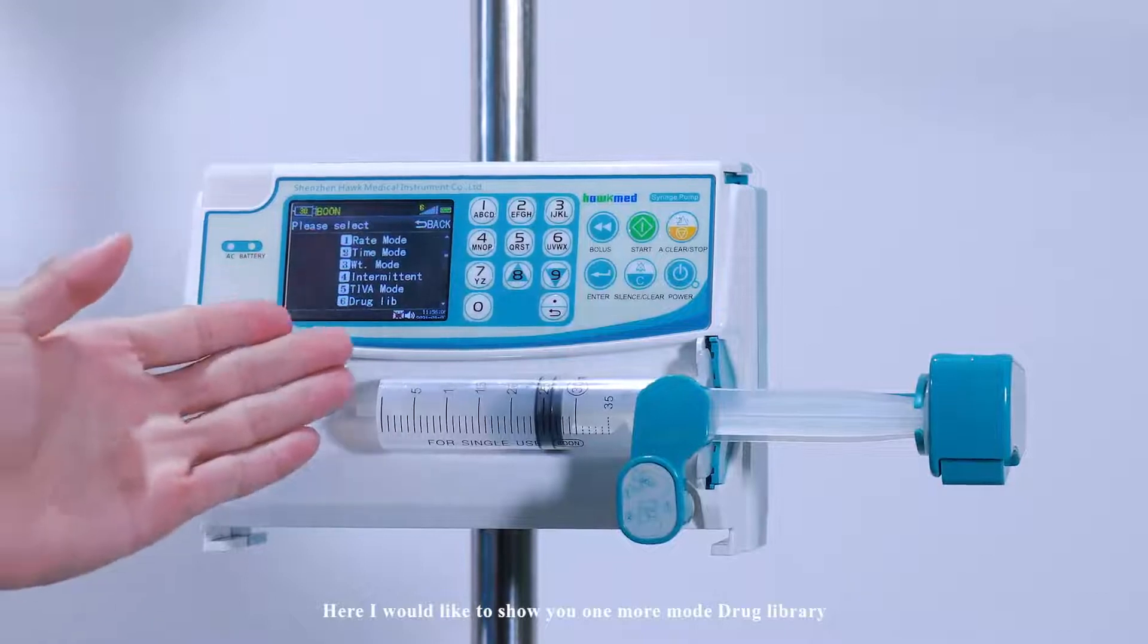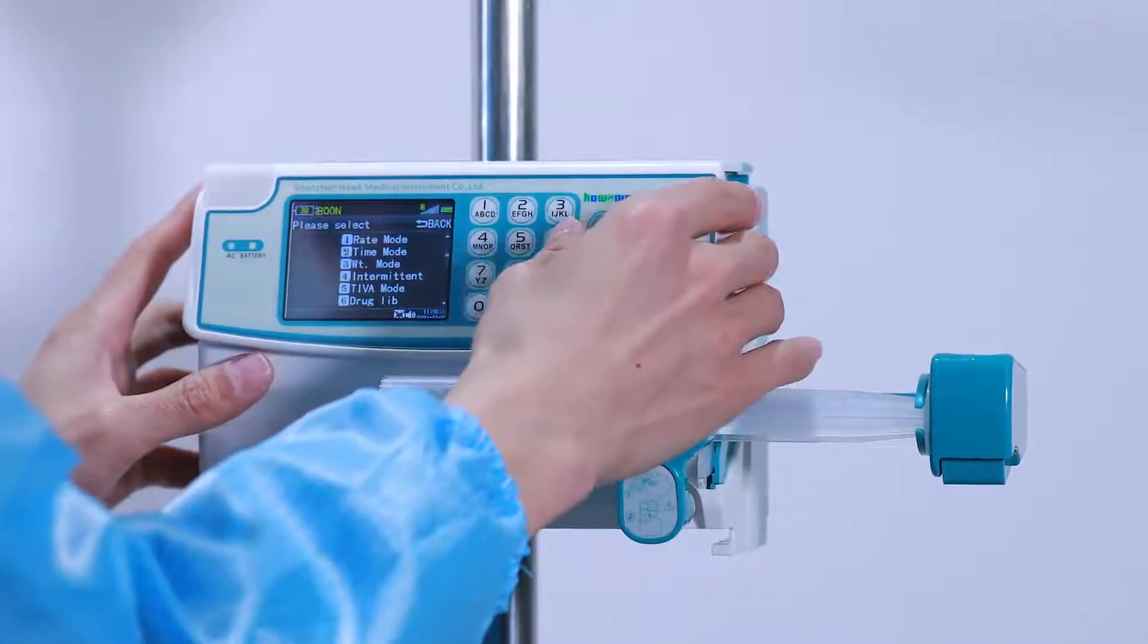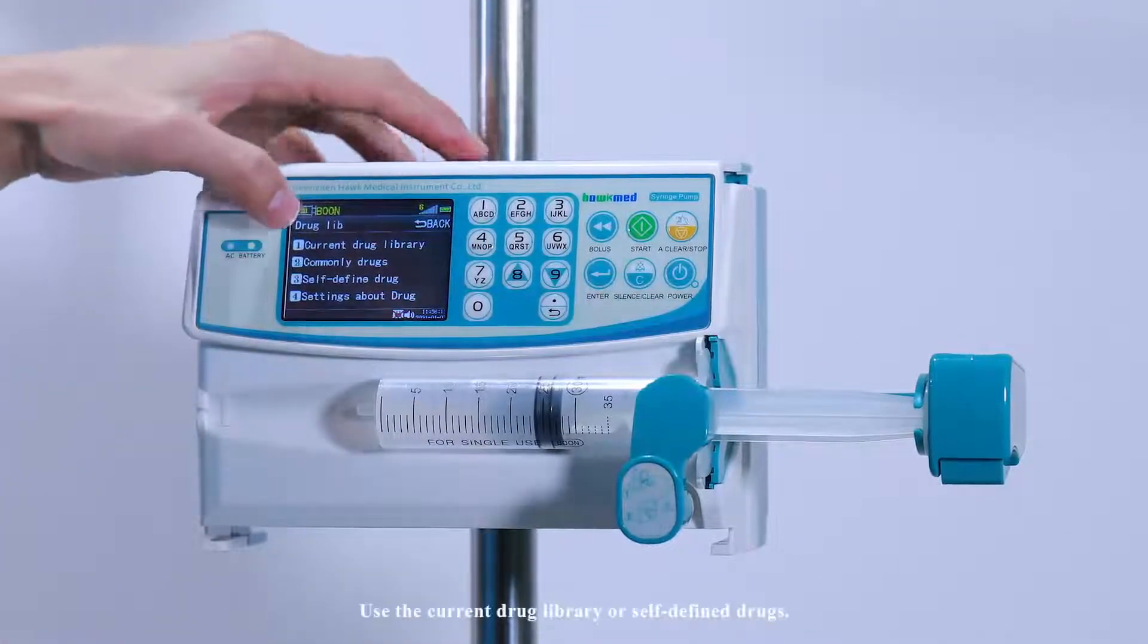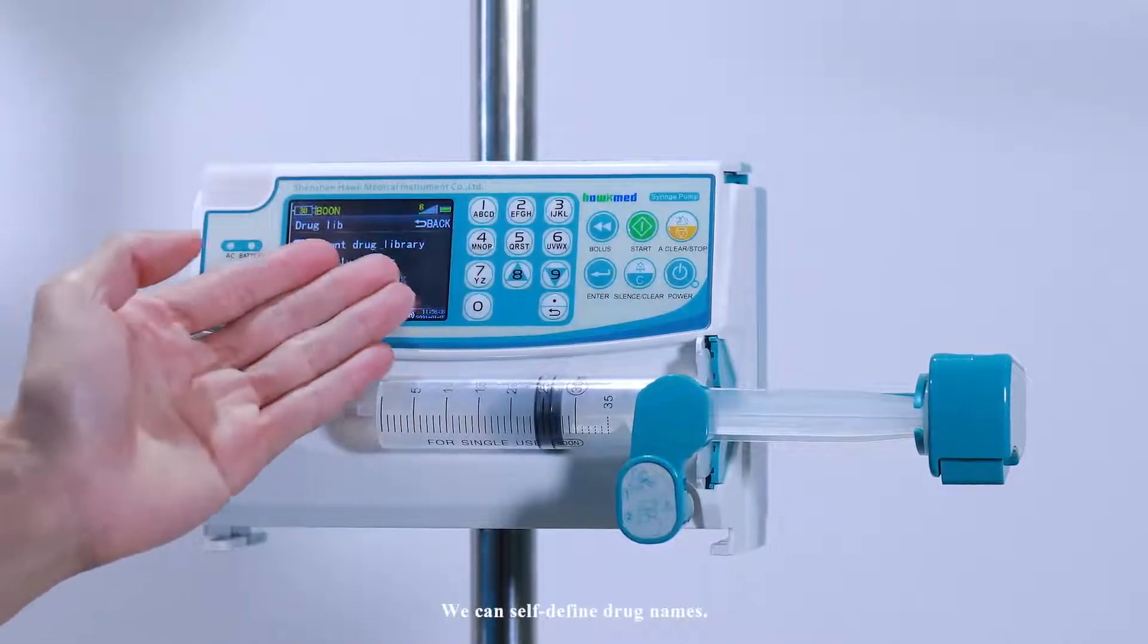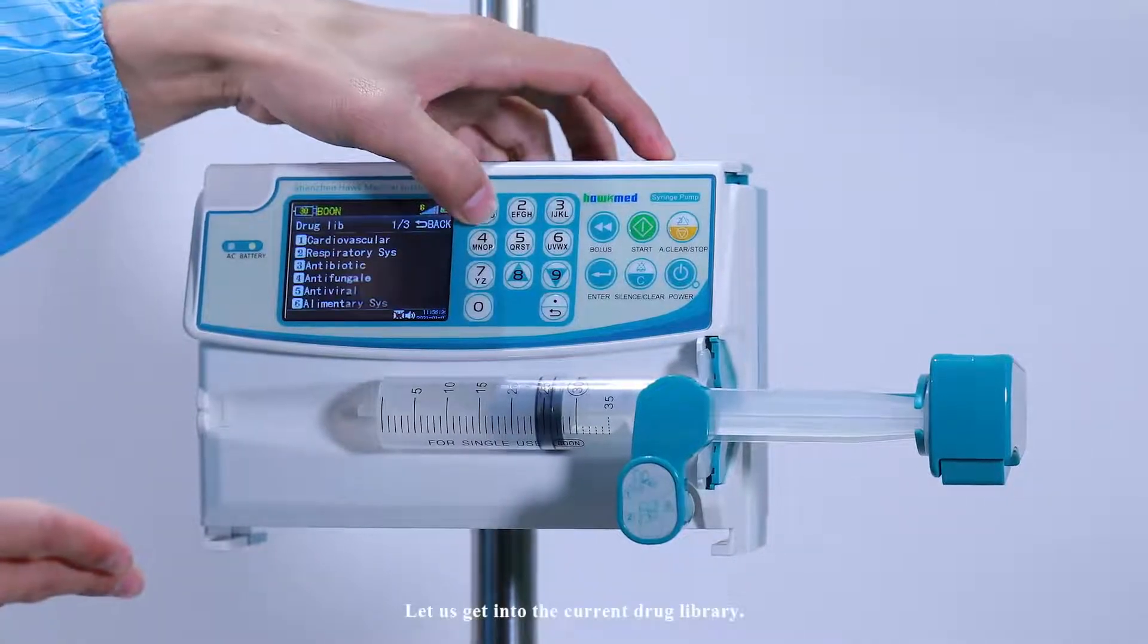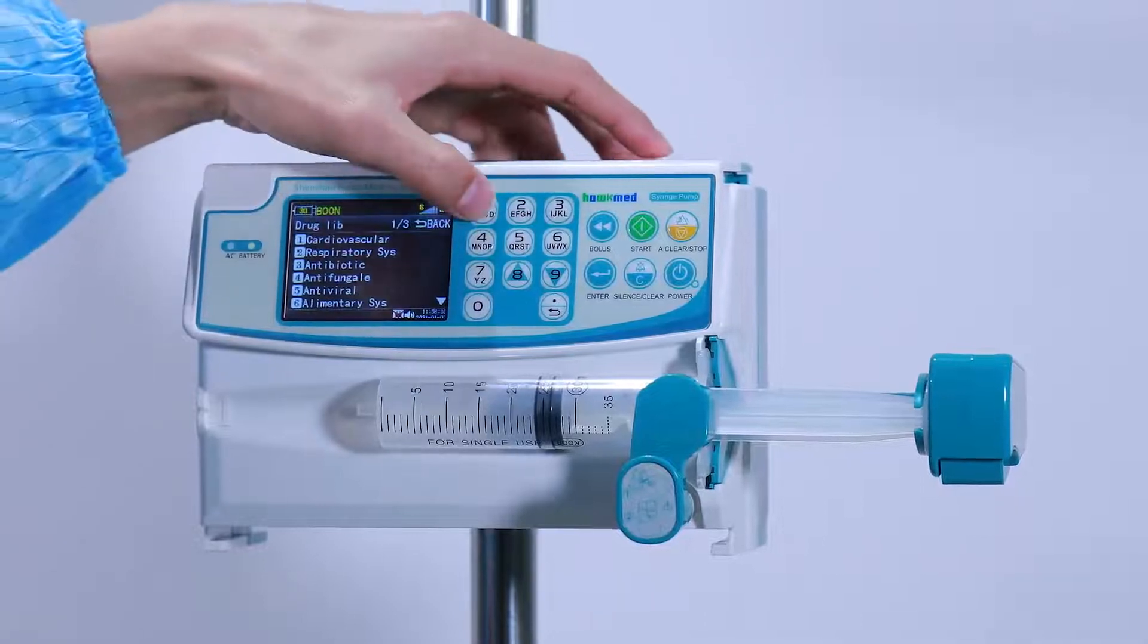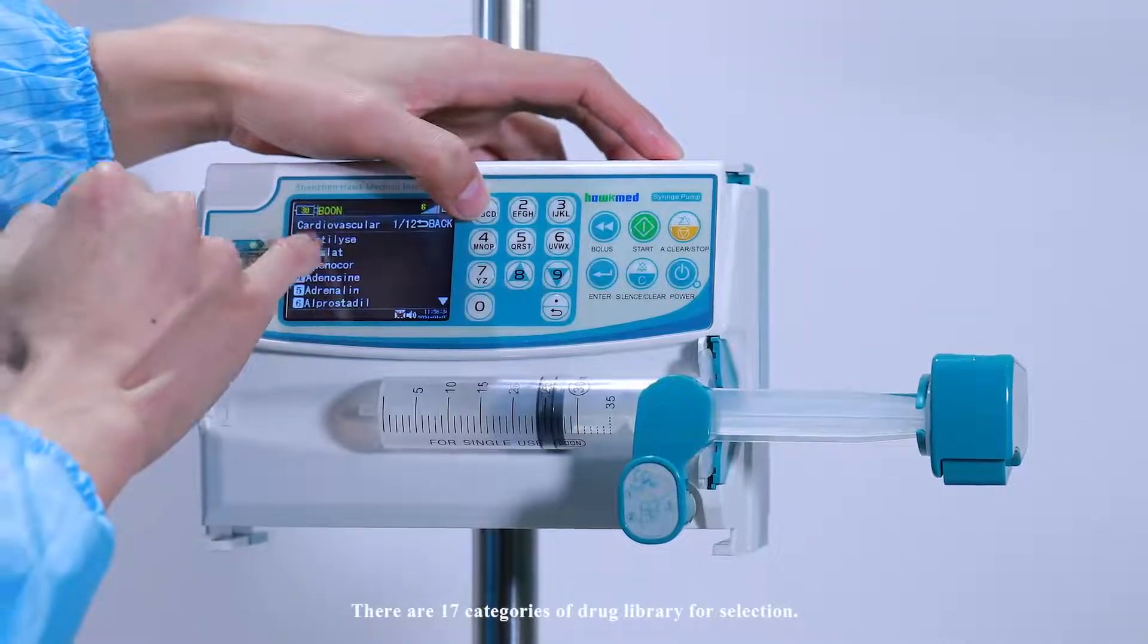Here I would like to show you one more mode, drug library. Press 6. Use the current drug library or self-defined drugs; we can self-define drug names. Let us get into the current drug library. There are 17 categories of drug library for selection.